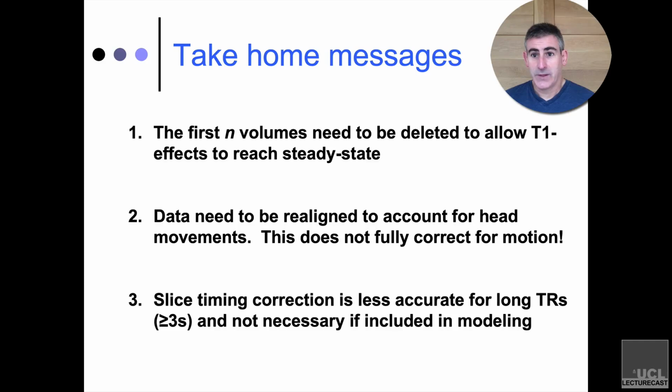So that's why I avoid the term motion correction. I will encourage you strongly to not refer to motion correction. There's a reason SPM calls it realignment instead of motion correction, and that is because it is realigning the data. It is not correcting for motion.